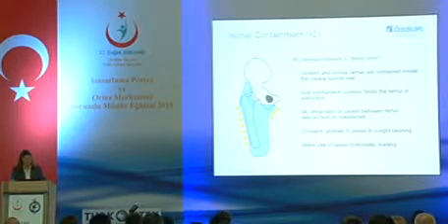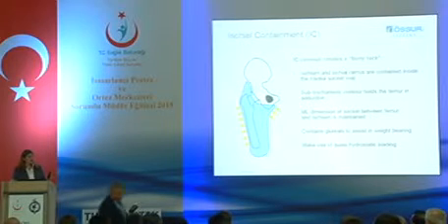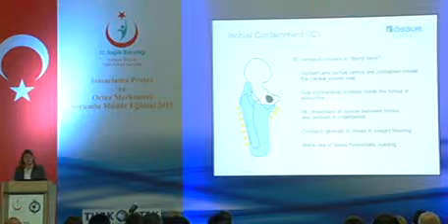The medial lateral dimension of the socket between the femur and the ischium is maintained, as well as it contains part of the gluteals to assist in weight bearing.